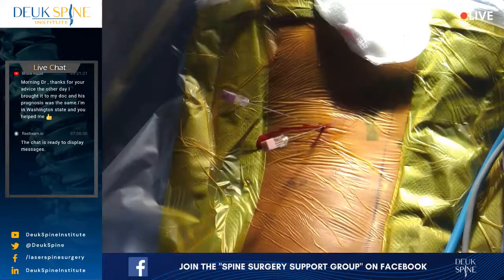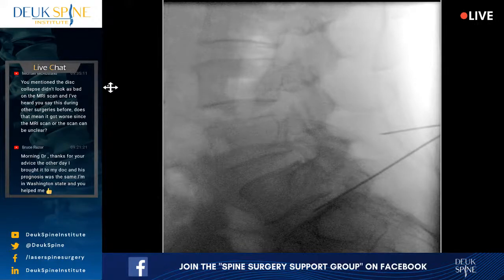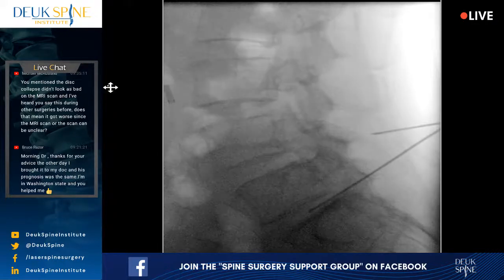What do you think, Luis? The spine at L5-S1, the relationship? Keep going, Jordan, until you get it right. All right, so it's neutral is clearly, in my opinion, not right. Let's keep going and see what happens. Just keep playing with it till you get it right. So the rotation or relationship is the best word. The relationship of L5 bone to S1 is going to be different than the relationship of L4 to L5. I think that's a little worse, because now we're looking down the facet joint of 3-4. That's better.